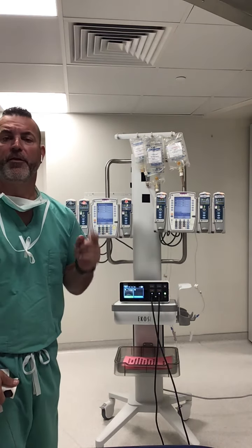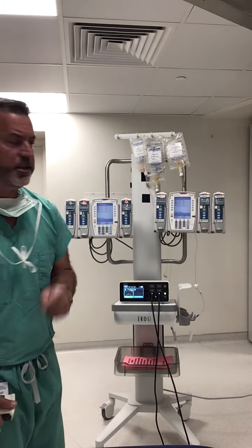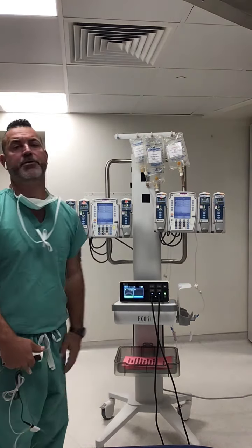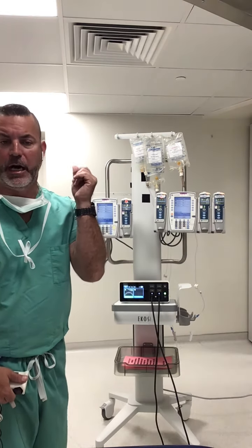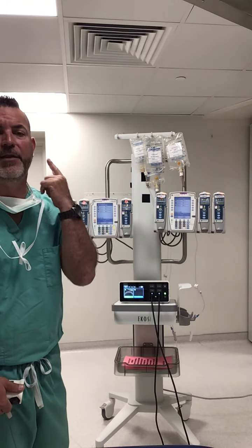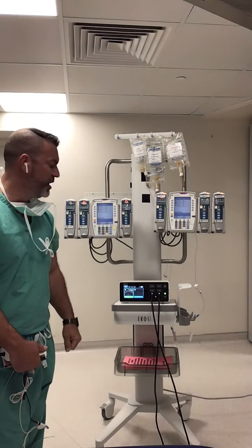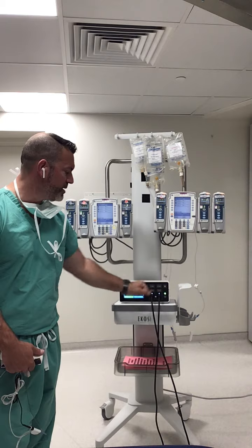The other reason would be for arterial peripheral vascular cases. If you are checking pedal pulses, you want to make sure to stop your ultrasound so that you don't hear our ultrasound waves inside the microphone of your Doppler when you're listening for the returning of pulses, okay? So those would be your 2, starting and stopping.